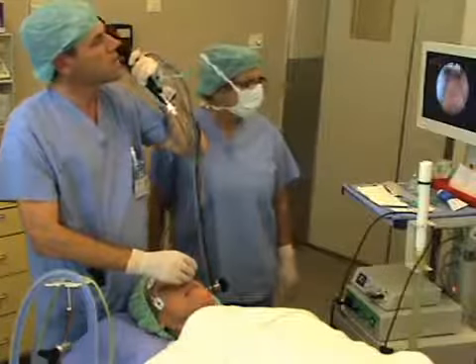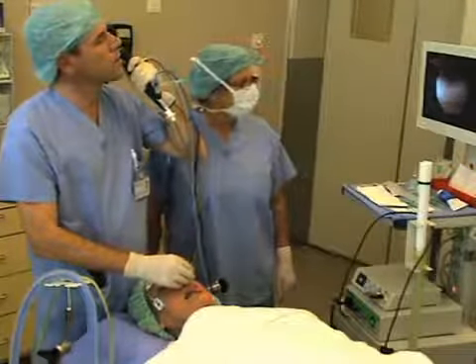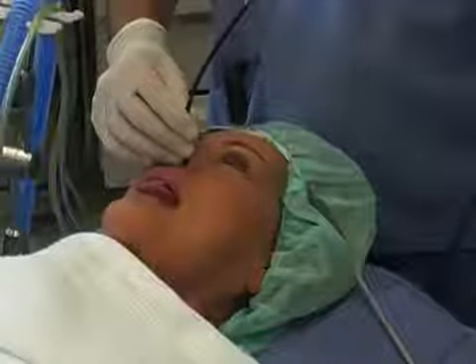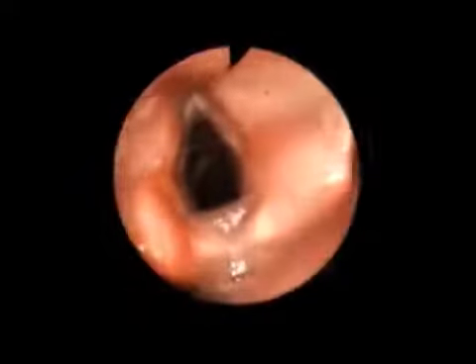When you reach the posterior nasopharynx, ask the conscious patient to stick out her tongue. This maneuver makes it easier to advance the instrument towards the epiglottis. Simultaneously, lift the tip of the fibroscope, making a slight downward movement with the thumb of the hand that is holding the instrument. If a patient is heavily sedated, a tongue traction maneuver is helpful.